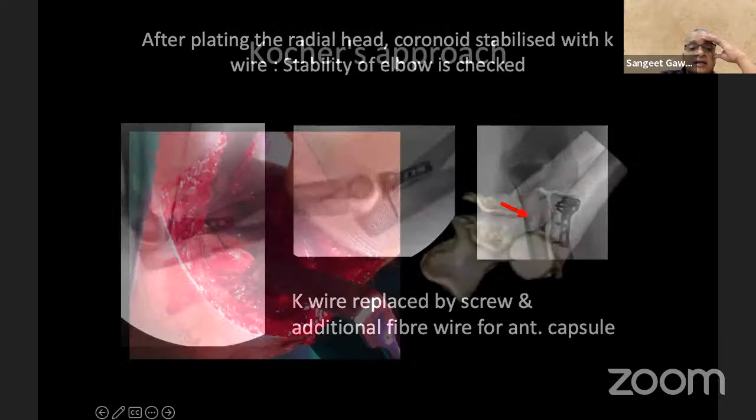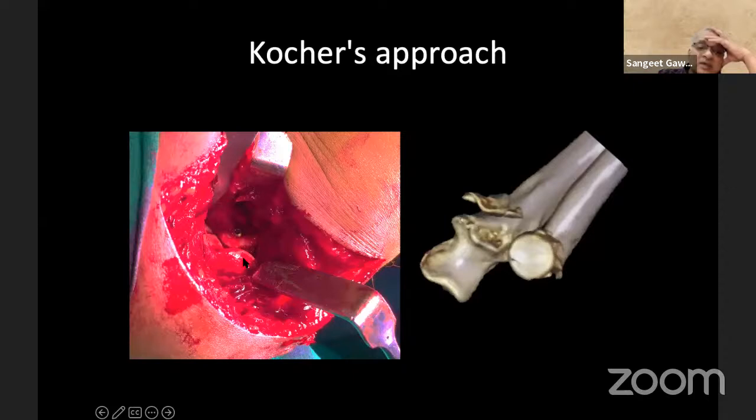So intraop picture, on your left side is the humerus. This is the capitulum. Okay. And that screw is fixing this fragment of the coronoid. So with the Kocher's approach, you can get that much of exposure so that you can fix the coronoid process in its footprints. Okay. So this is the capitulum, that is a fixed coronoid with a screw.